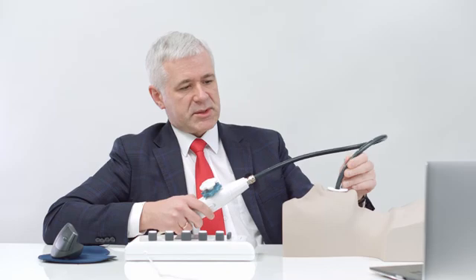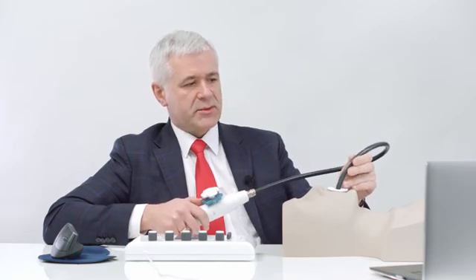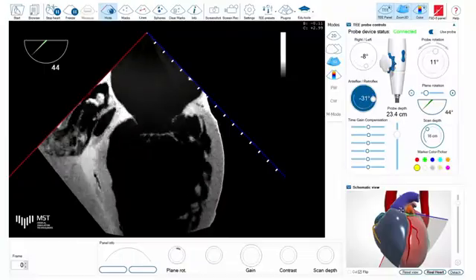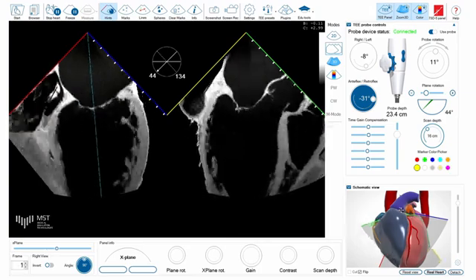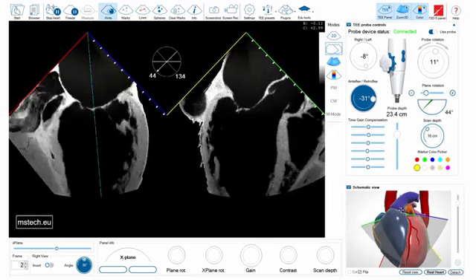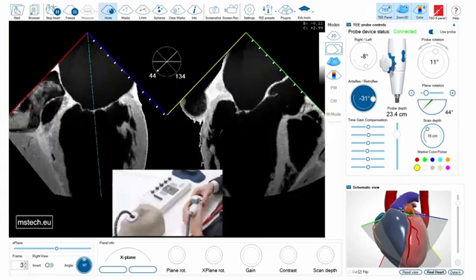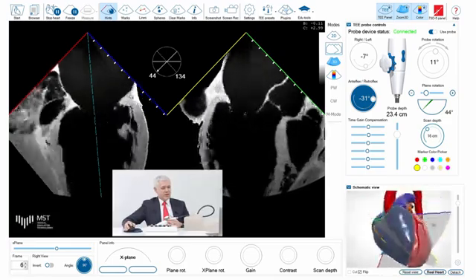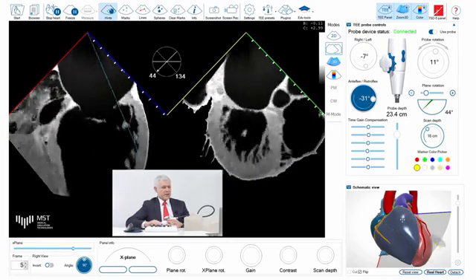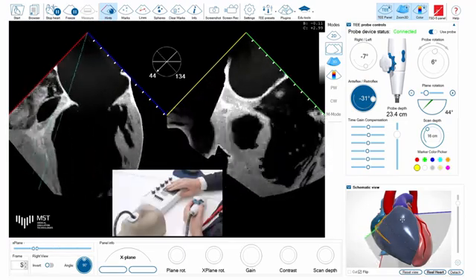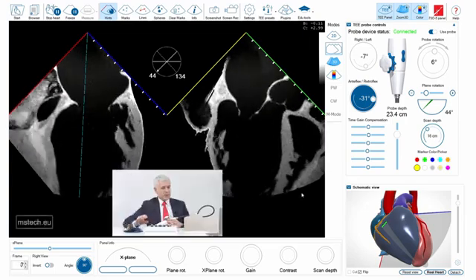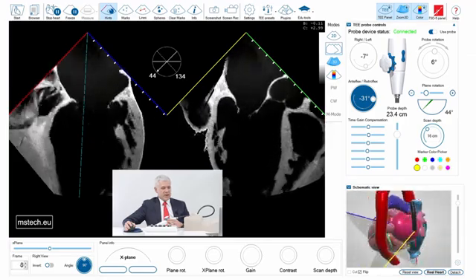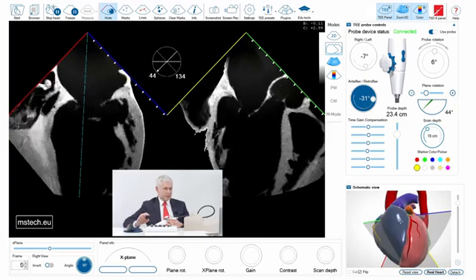I can also use the X-Plane mode of this simulator. Similar to contemporary 3D echo machines, I can use this mode to see two perpendicular planes, which are marked with colors — blue and red as seen before, and yellow and green for the perpendicular plane. I can manipulate the angle of the secondary plane with the trackball as on a regular echo machine, so you can easily check the position, the angle, and all the anatomical aspects of the simulated echo.